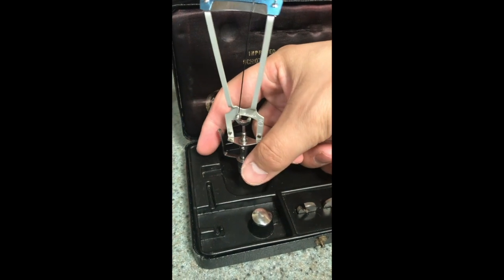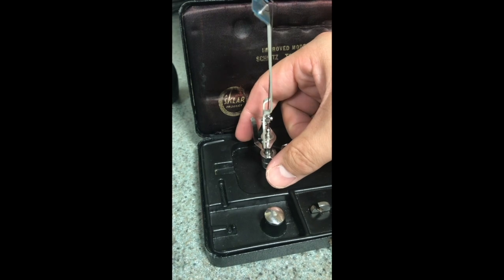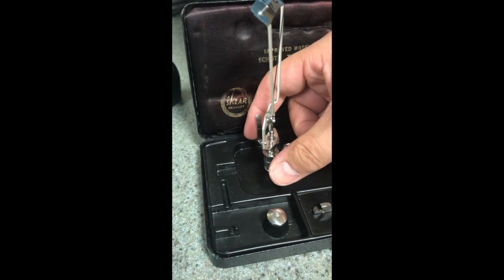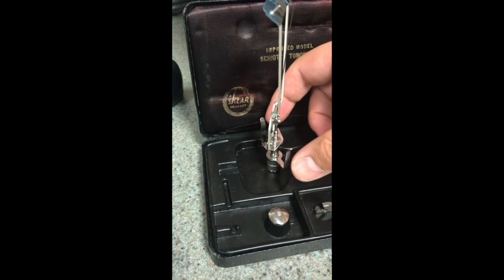It has these holders here on the side, where my thumb and index finger are, that help you to hold the device without actually putting pressure on the scale, throwing off your measure.